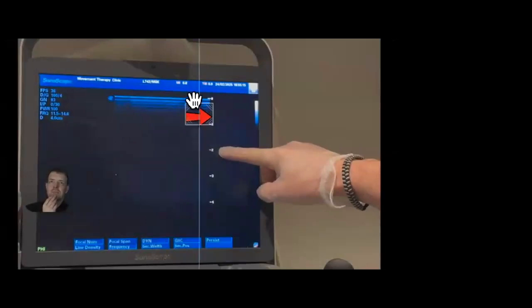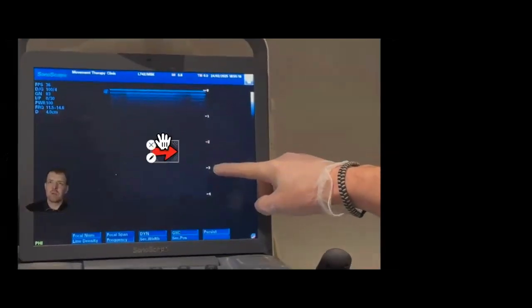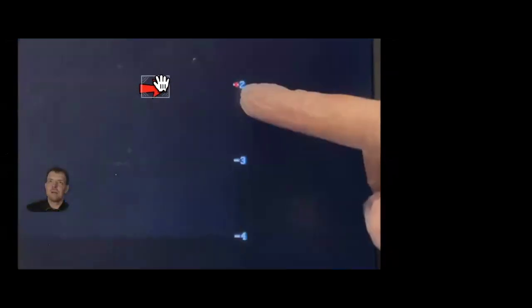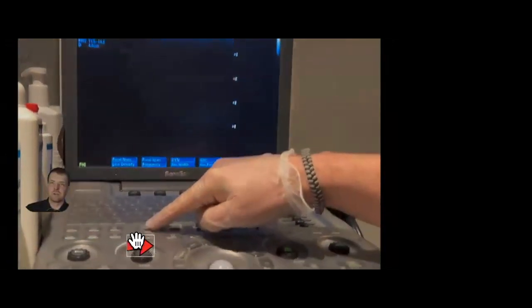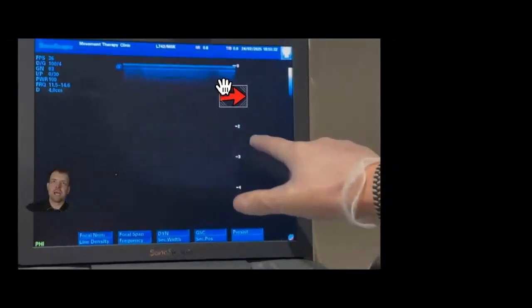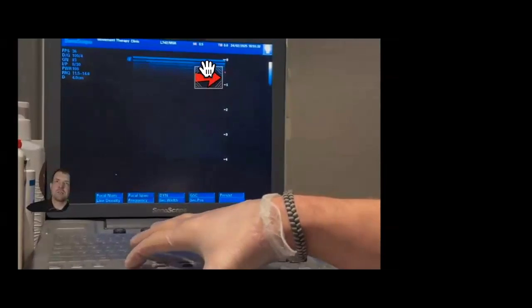So there's the depth down the side. Okay, so we've got 1 centimeter, 2, 3, 4. And then hopefully you'll be able to see, I think we zoom in a minute, where there's a little red arrow next to that 2, that number 2 just there. So I want you to keep an eye on that red arrow. There you go. You can see it just there. So what I can do, I can change the focus. So I press the focus button. And what it will do is it will move that arrow up and down the depth. Can you see it there? So it's gone up to 1/2 centimeter, 1, 1.5.